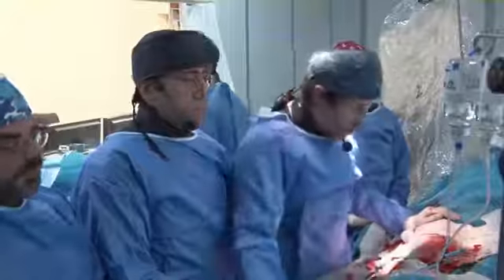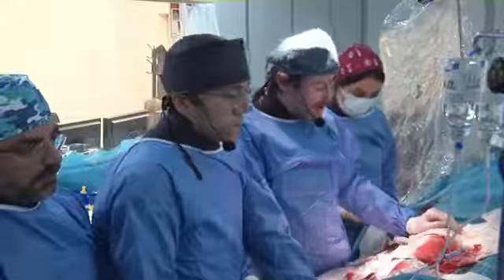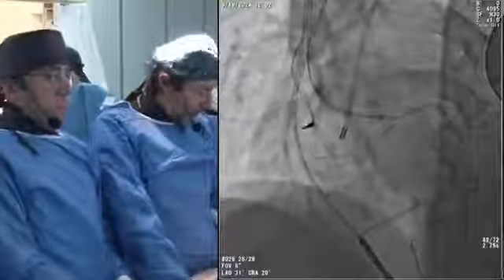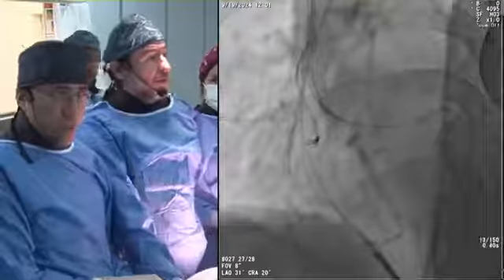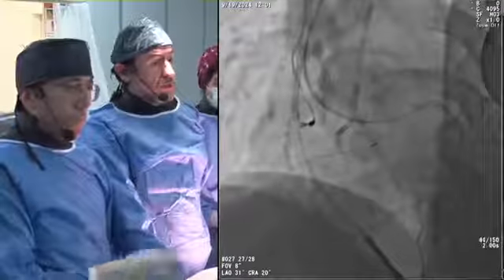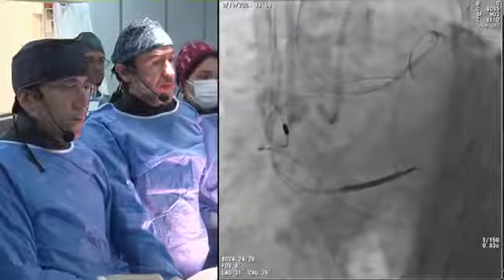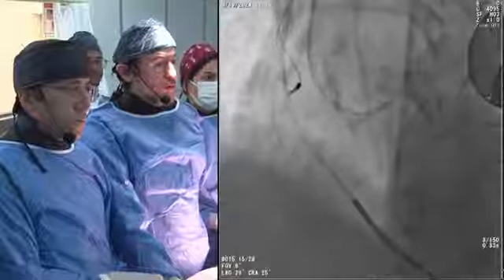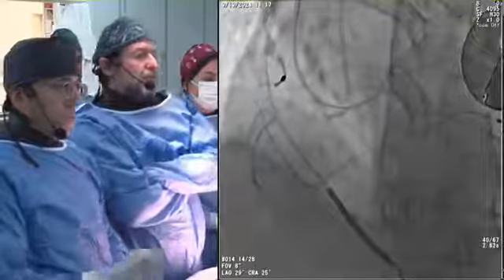Let us show you what we have done. So, luck is this time on my side. Show us, guys, where we left you. Go back. Oh, you are into the aorta. I hope so. Wow. So this was this. Yeah. So next one.